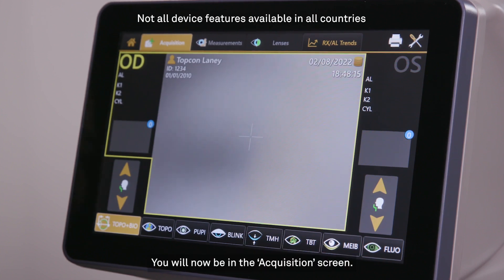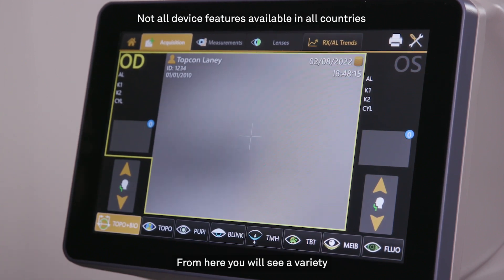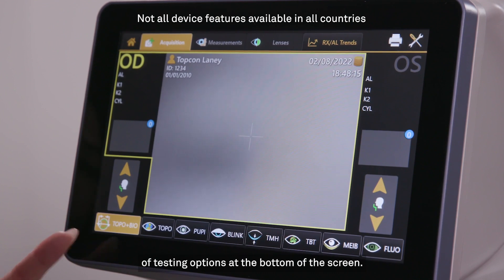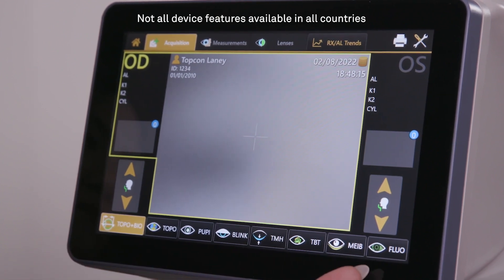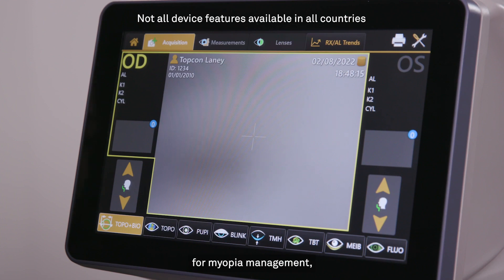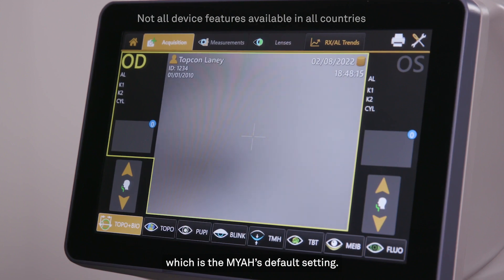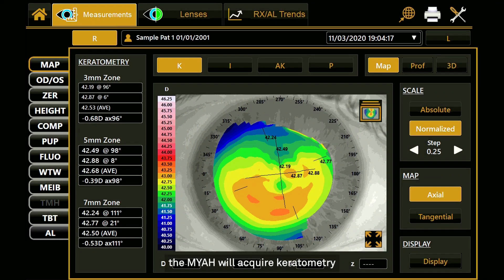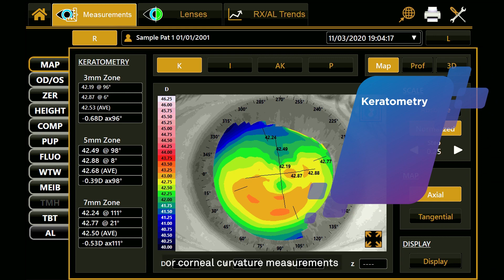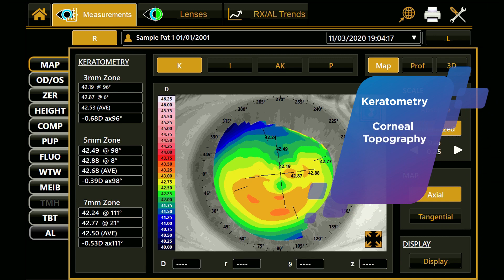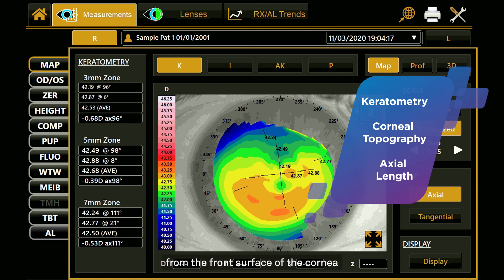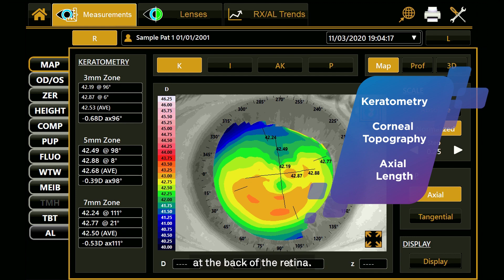You will now be in the Acquisition screen. From here, you will see a variety of testing options at the bottom of the screen. For the purpose of testing for myopia management, we will be using the Topography plus Biometry setting, which is the Maya's default setting. In this testing mode, the Maya will acquire keratometry, or corneal curvature measurements, as part of the corneal topography assessment, and axial length measurements, which is the distance from the front surface of the cornea to the retinal pigment epithelium layer at the back of the retina.